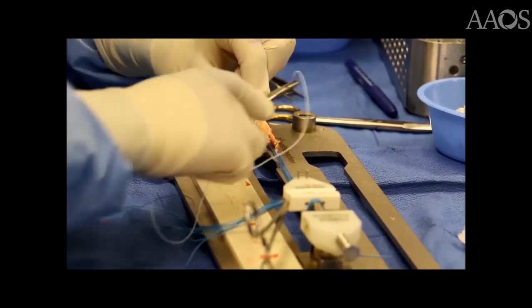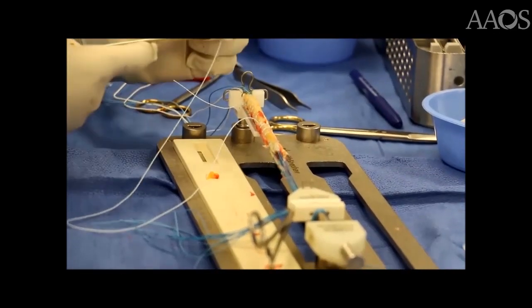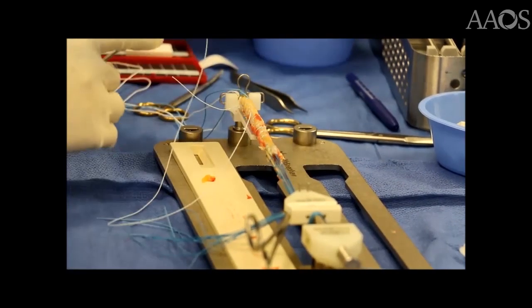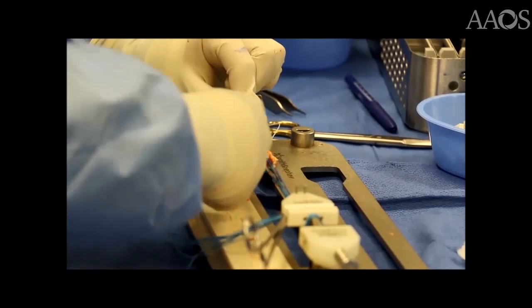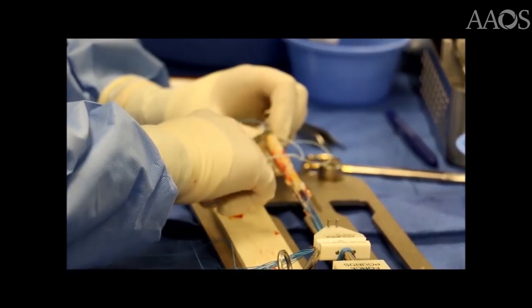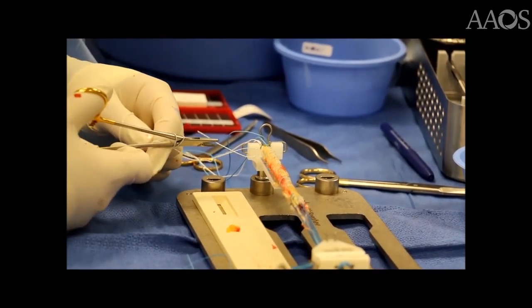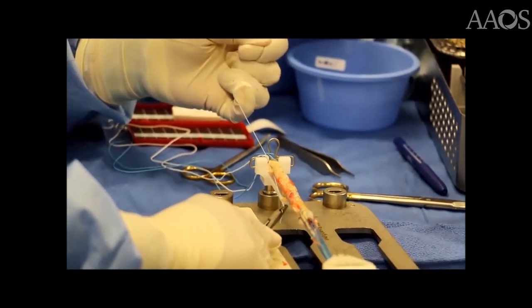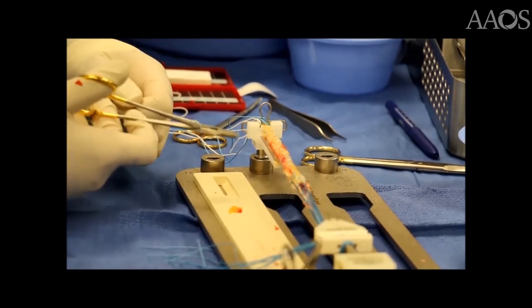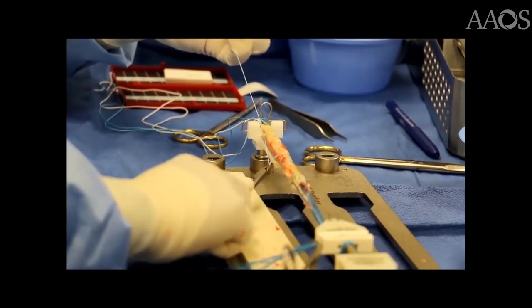The braided suture is then run back up the opposite side of the graft, ensuring to incorporate all tendons. Once the suture is run back up to the looped end, a knot is tied and buried in the middle of the graft so as to avoid any irritation from the suture knot. The graft is soaked in mineral oil under tension until ready for insertion into the knee, with the mineral oil acting as a lubricant to help pass the graft.